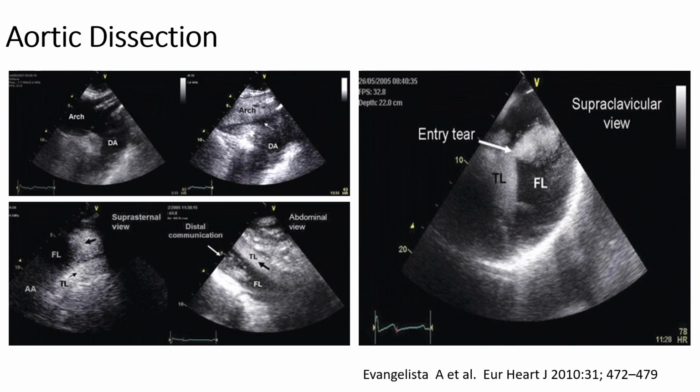were similar to conventional transesophageal echo in detecting dissection of the ascending aorta, on the order of 93 versus 96% and 98 versus 96% respectively, as well as in the arch.